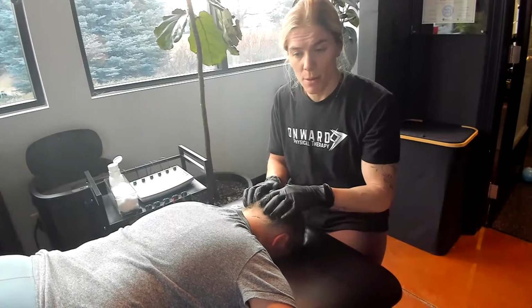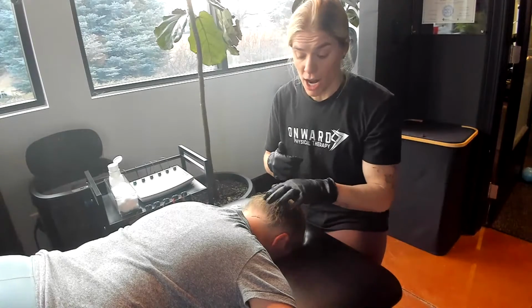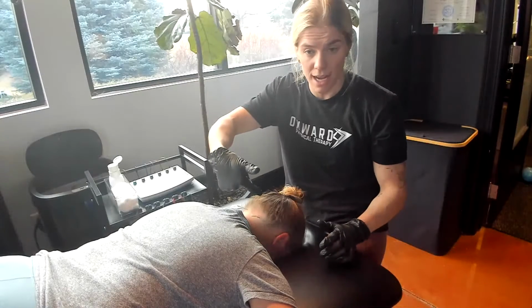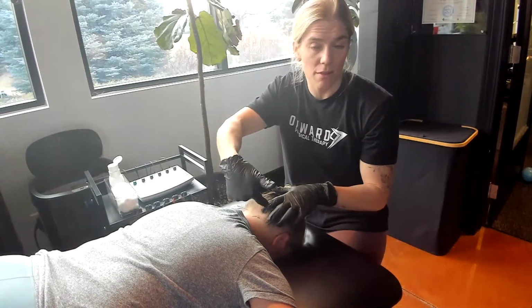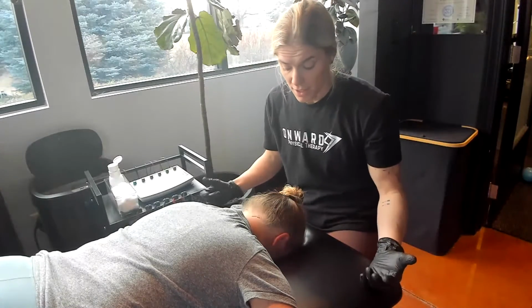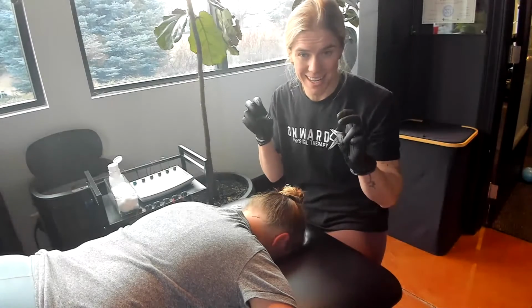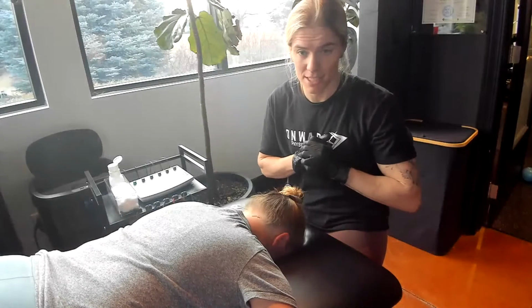We're using a firm compression to mitigate the sensation of the needle insertion. Upper trap is going to be perpendicular to the occiput. Needle direction is towards the eyeball, ipsilateral eyeball. Semispinalis is just about a finger breadth lateral to that, and we are angling the needle towards the contralateral eyeball. So there we have the needling technique for treating the suboccipital headaches. That is actually the occipital insertion of upper trap and semispinalis.